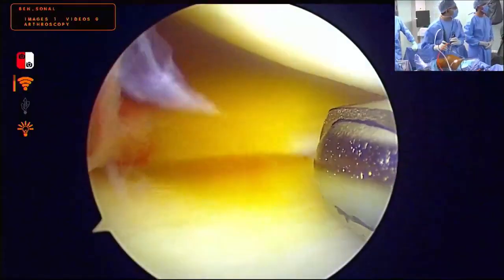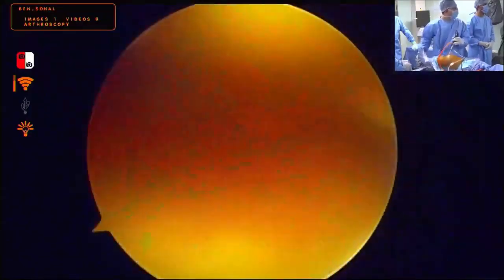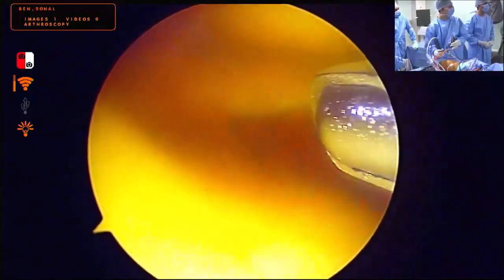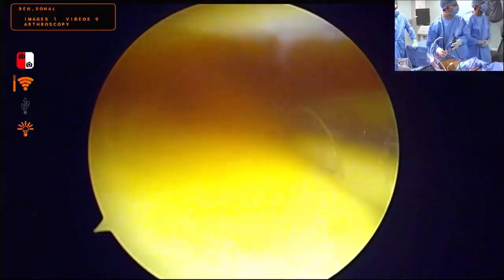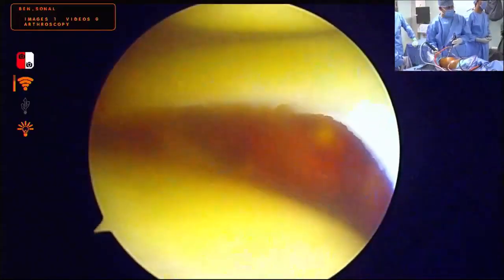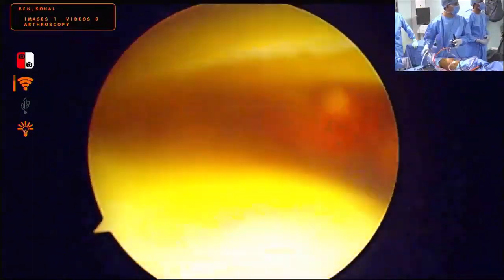And there is a significant opening on the medial side, you can appreciate. There is a gross opening, wide open MCL on the medial aspect. Top. So the almost grade 3 plus opening on the medial aspect. So grossly increased opening on the medial aspect. Okay.